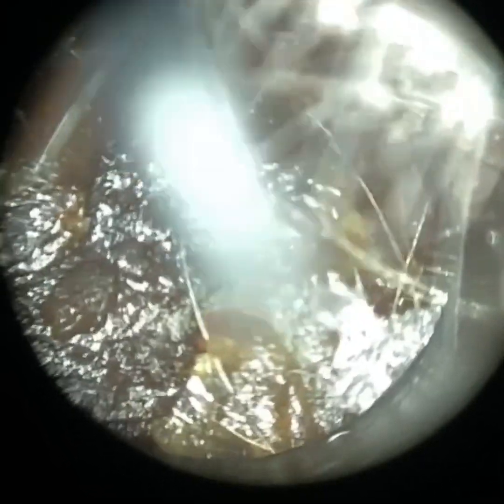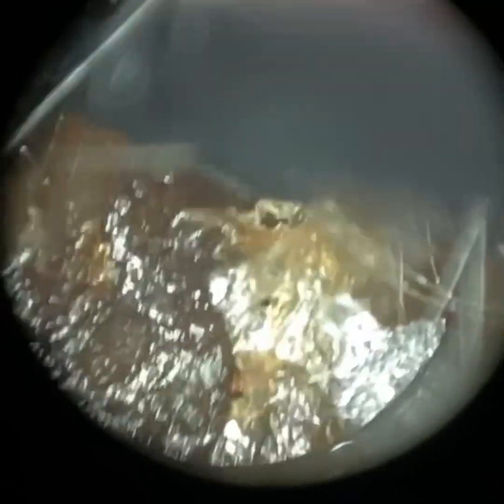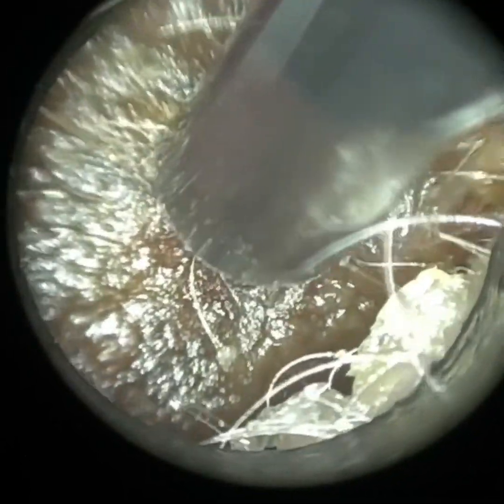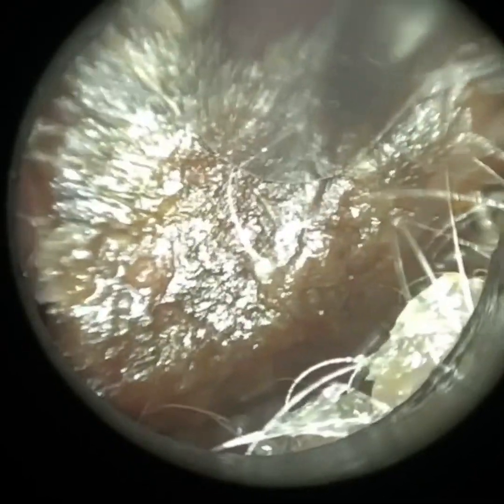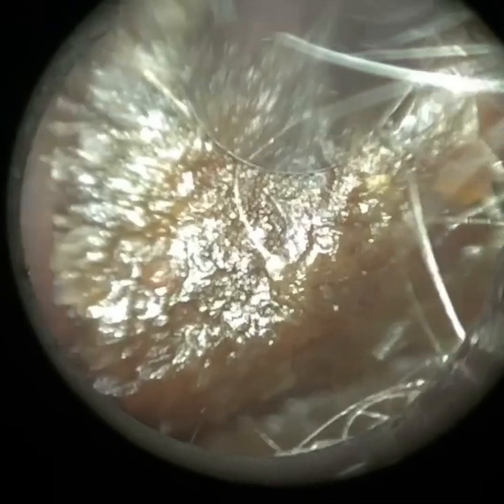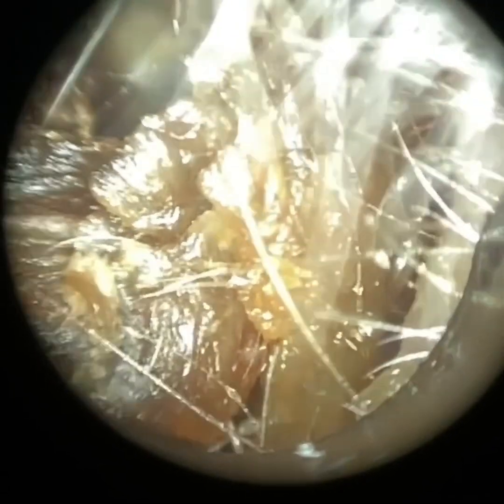The plug of wax at this stage was just too dense. The surface wasn't soft enough for me to use the suction probe, so I'm just inserting the right-angled ear hook. Although I penetrated it into the core of the wax, in the core it's quite crumbly, so instead of extracting it in one piece it just dissected it. Which is not a problem, because that can still facilitate the removal — you're breaking down the plug into smaller pieces, segments. It still does help the procedure, even if it doesn't remove the wax in one singular piece.